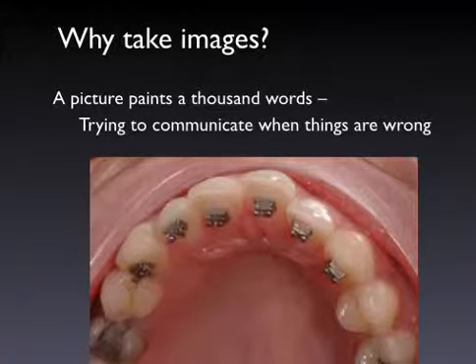It also helps communication with our colleagues. So in this lingual case, the brackets were positioned using the best technique, bonding with equal specific thickness. Now, to do this, we need two bits of equipment: a BPD, bracket positioning device, and a TAD, torque angulation device. Now, I received the lab work from the technician, bonded the brackets, and this is what they looked like.